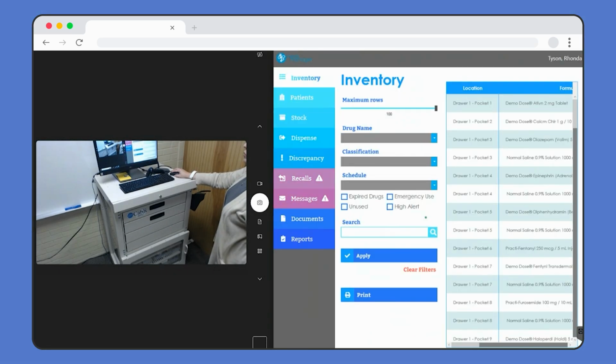When the system completely propagates, I now have tabulations on the left-hand side of the screen, as we've noted from previous MedsManager lessons. In this instance, at the cabinet, most commonly the student will drop down to the Dispense tab for removal of a medication to relocate it either to a medication cart or to take it to the patient bedside directly. Either is appropriate based on the faculty desire.